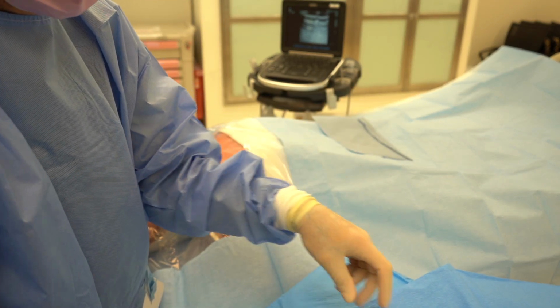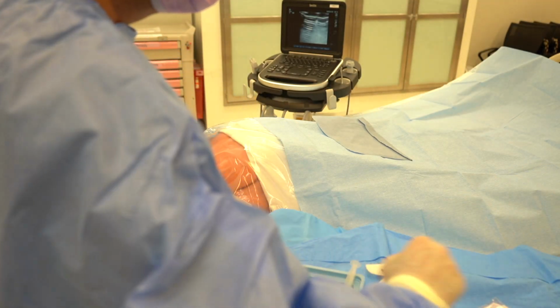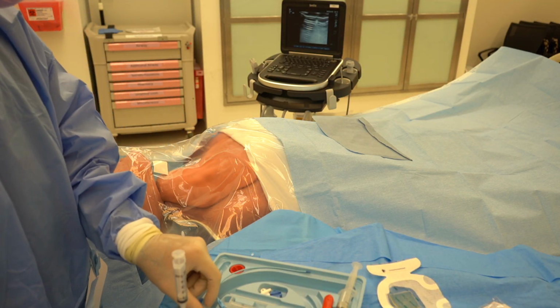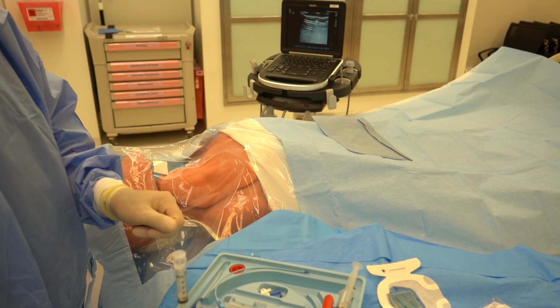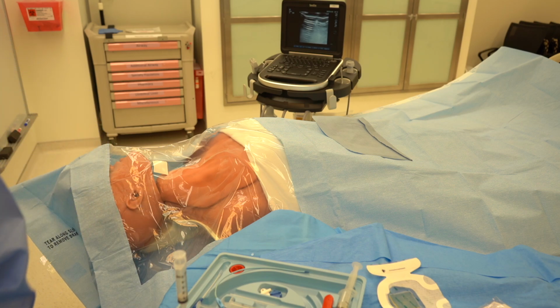Now, something not seen in this video is the monitor to my right, which is facing me so I can see if any alerts pop up. I have a good understanding of the basic rhythm seen on the screen in case there's any deviation from that rhythm as I proceed through the procedure. At this point, I'm going to get my probe cover, and you can see here I have my probe pre-gelled. Certainly you can use the sterile gel in your probe cover, or you could have someone pre-gel your ultrasound and hand this to you. In this case, I'm working independently, so I'm grabbing that probe cover to set that up.